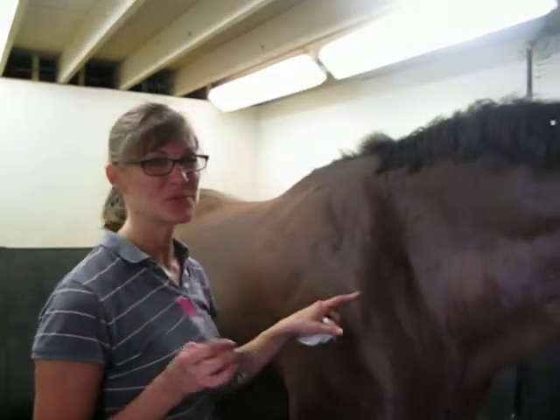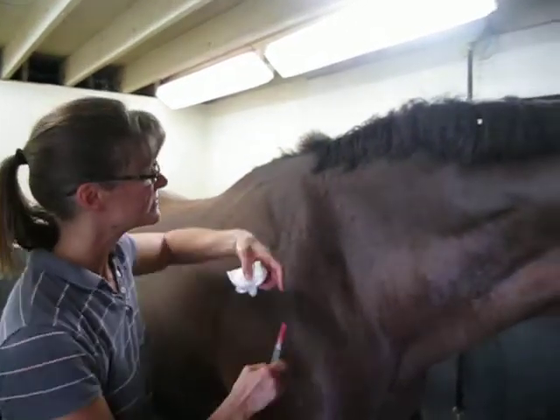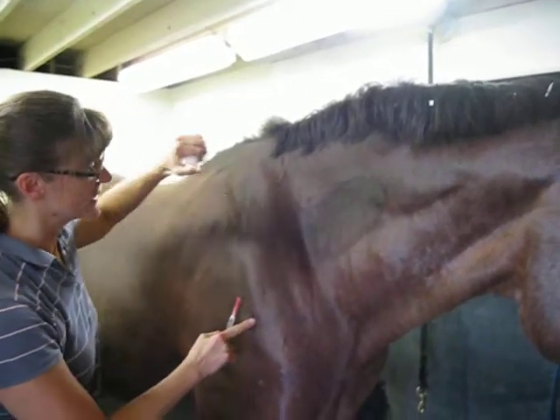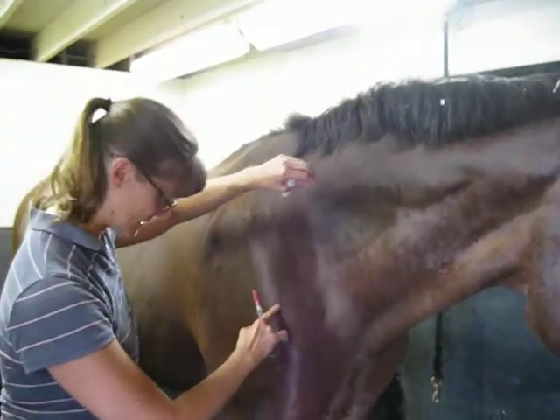I'm going to do the sub-Q injection. We're going to alcohol the area. And I'm going to lift the skin up and tent it.